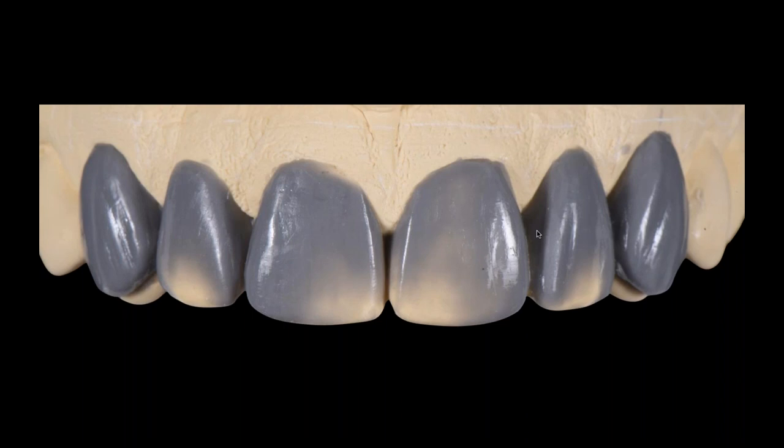And this is what we thought we were going to do, until we realized that if we did that, his cuspids were the first point of contact that he had when he closed his mouth. It's kind of a class 3 articulation. So if we touch those cuspids, we're changing him functionally. We're changing who he is. And once we do that, this really becomes a full arch, and we didn't want to go there. So we decided to opt away from touching his cuspids and just focus on the 4 teeth.